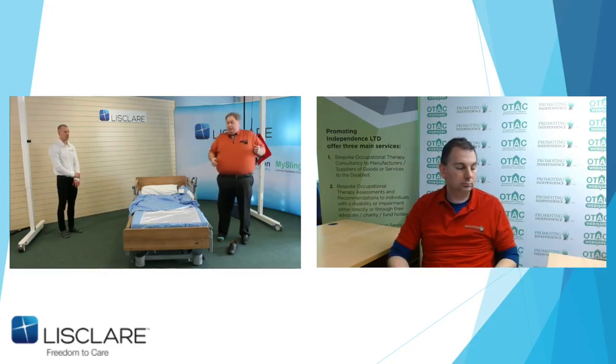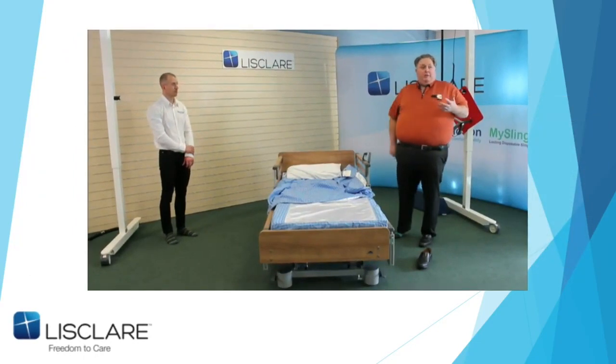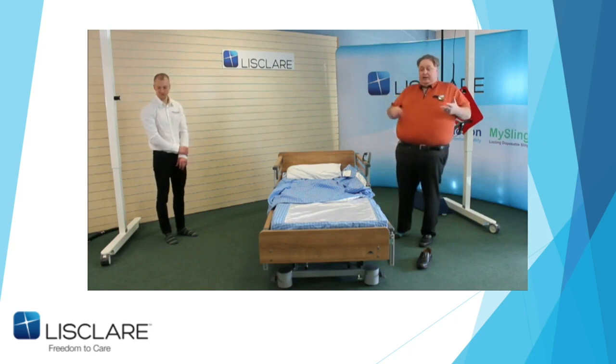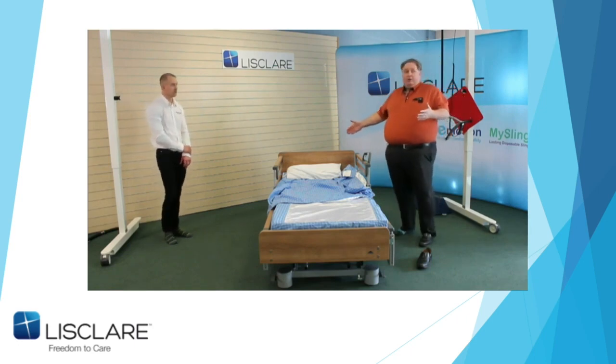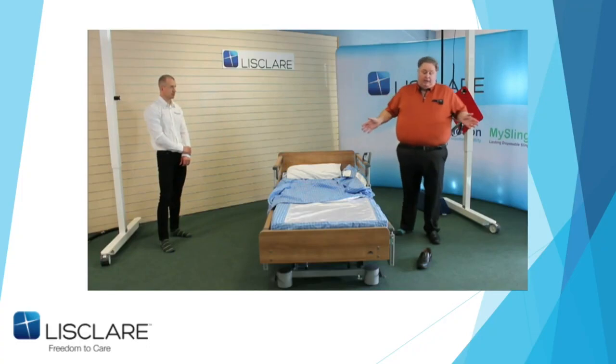Because if you've got to try and approach a patient now and get a sling on, you're going to have to turn them. You're going to have to try and get the sling on and turn them back again. Whereas it's already on the bed. All you're doing is repositioning. And as I was doing that, I could have actually applied the sling to John after cleaning them and turned them back with the top sheet, and the sling's already on.